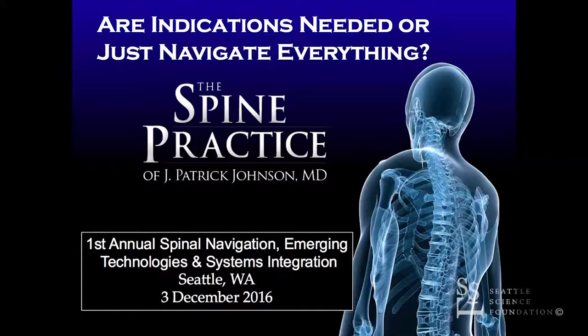I'm going to give a talk, and I'm not going to go through any of these text slides very much, but I'm going to show a lot of pictures. Where and when do we use image guidance? That's really what this is about. Do I use it for laminectomies and things like that? And the answer is no.